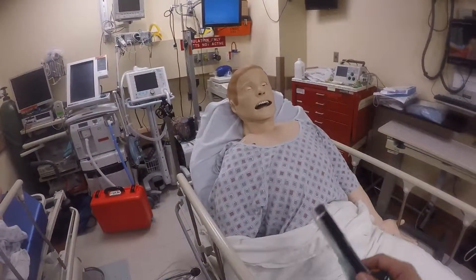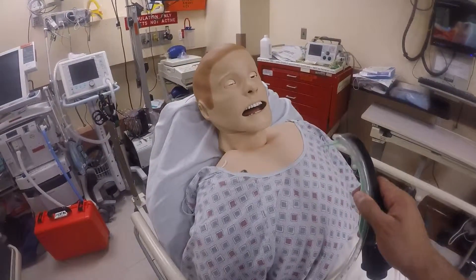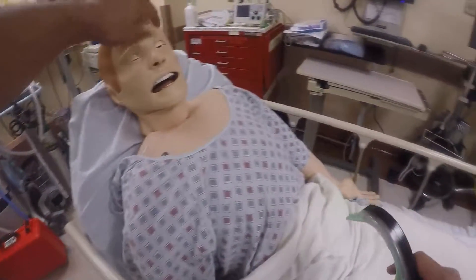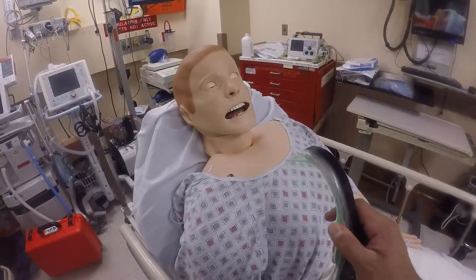The patient is very sedated, possibly from sedation I gave him, hypercarbia, hypercapnia, or an opiate overdose or benzos he took. I'm going to protect his airway and take a look, hoping he doesn't have the worst gag reflex I've seen.